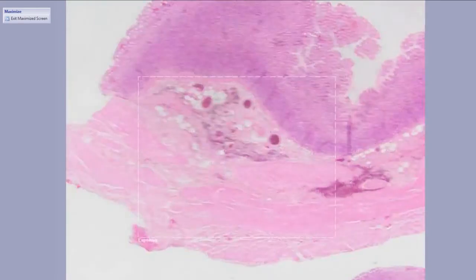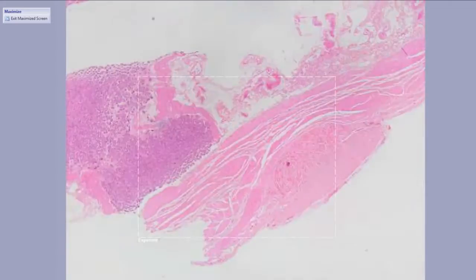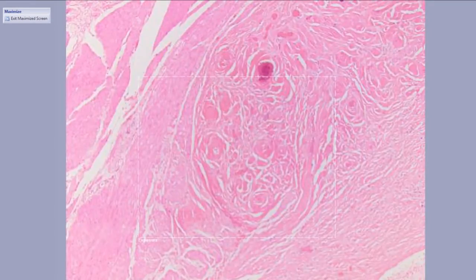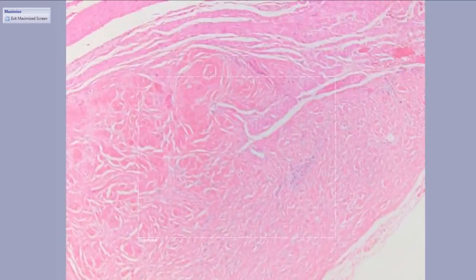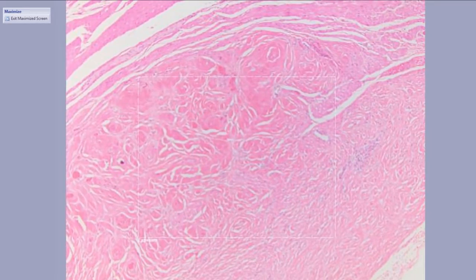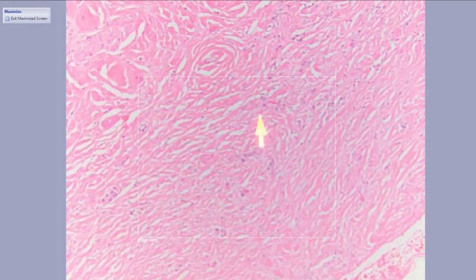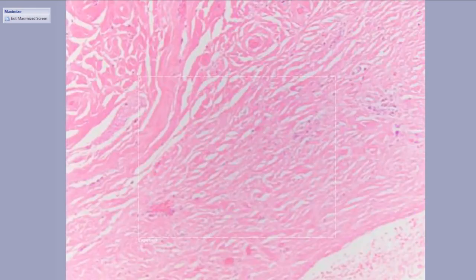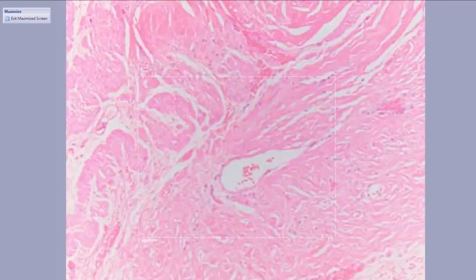This is another stomach lesion, although this was incidental. This patient had morbid obesity and underwent a sleeve gastrectomy. They saw a little nodule along the wall, which we're going to see right here. And this is also spindly in a sense, but it's very densely collagenous or fibrous. You can pick out a hint of a spindle cell or almost epithelial proliferation in the background, but the most striking thing absolutely is the dense fibrosis.